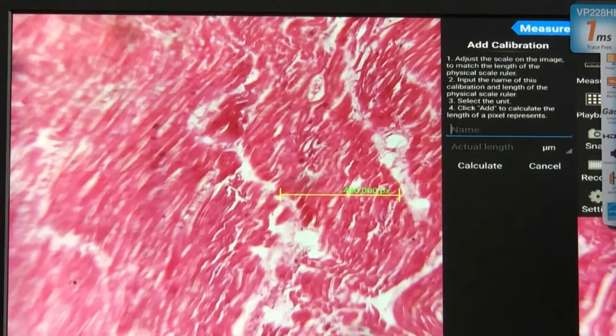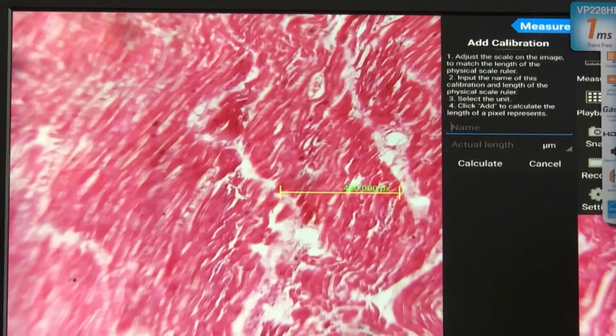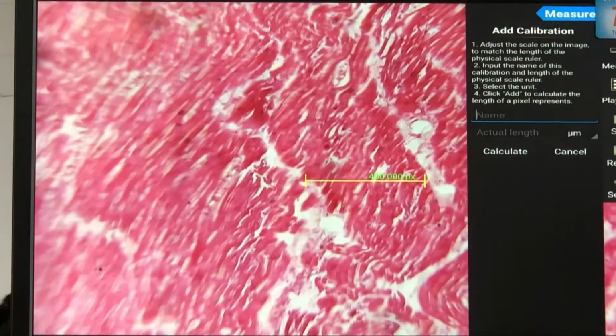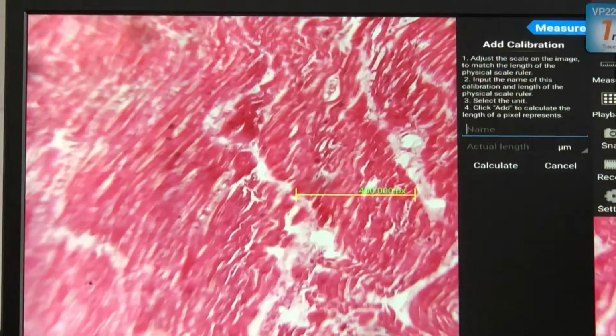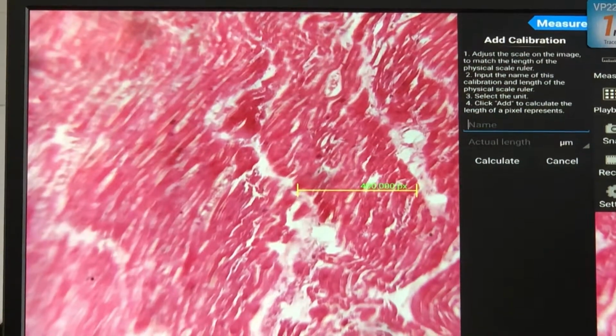Okay, so what makes this a hypertensive heart disease? With this one, in hypertensive heart disease the nuclei are bigger, usually boxcar in appearance, and then there will be hypertrophy of the myocardial fiber.